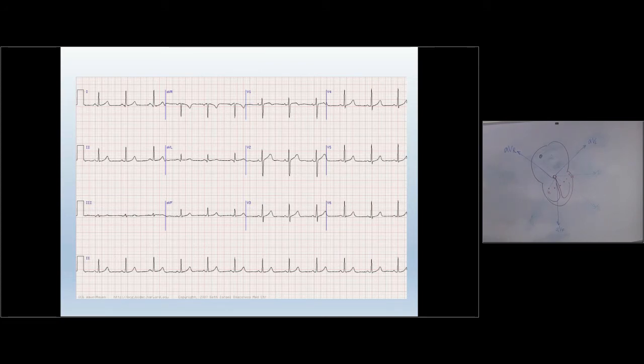Alright, now we have the rest of the 6 leads. They all are in your vertical plane. Now, did you all understand this one? So this is the basis of ECG: how various electrodes are positioned around the heart in 2 different planes, the vertical and the horizontal plane.